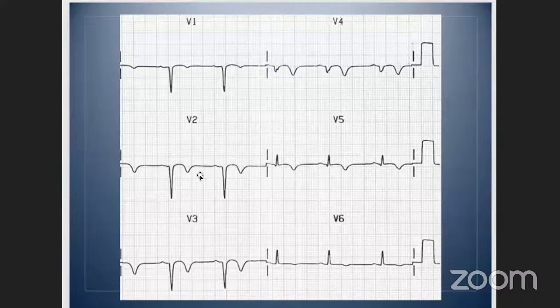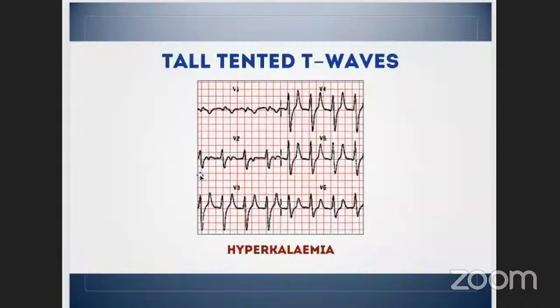And so it's difficult to see this ECG, and not many people would be familiar with this, but we still do know what is normal. And so we're able to say this is aberrant, and the patient with this type of ECG does need repeat ECGs, serial ECGs, cardiac markers, and further workup. I'll touch on this ECG again later.